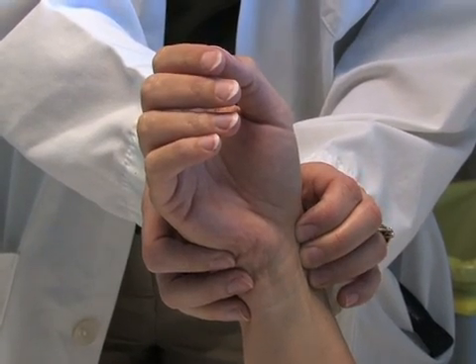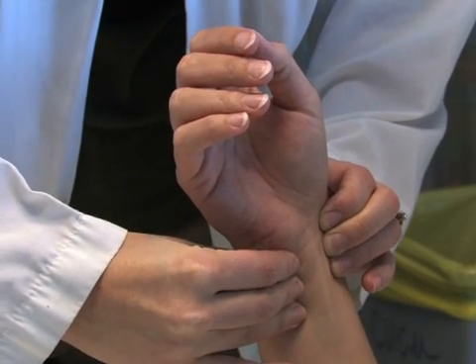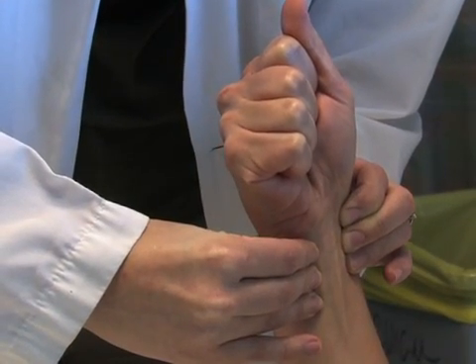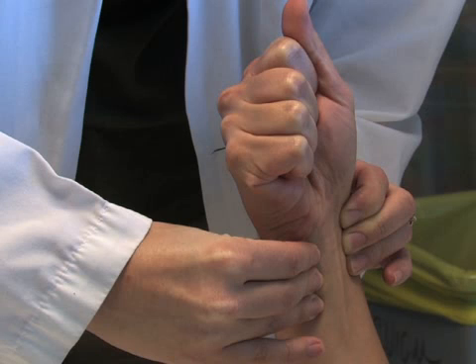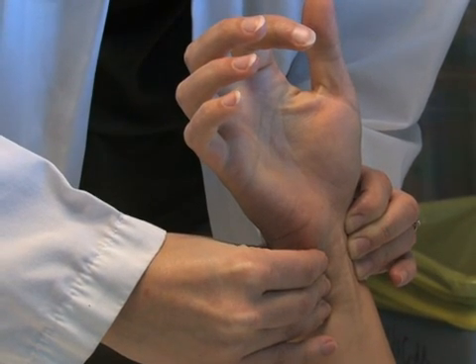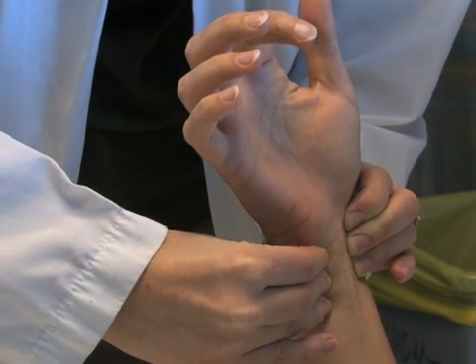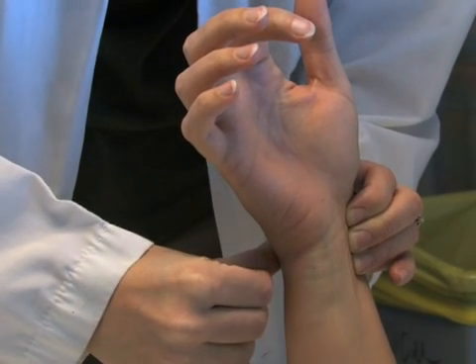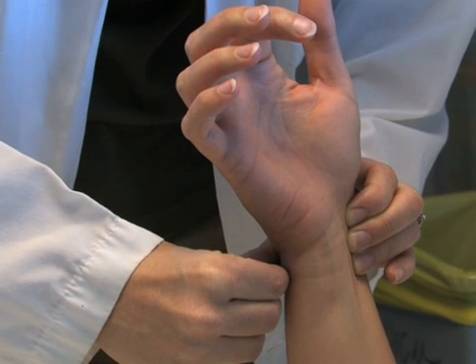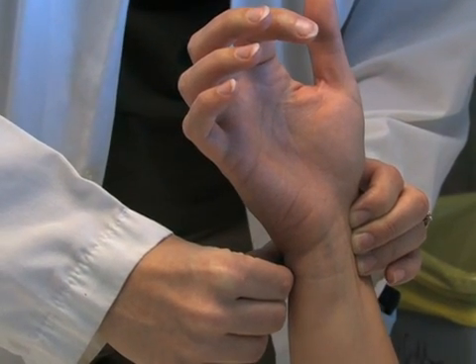To perform the Allen test, occlude both the ulnar and radial arteries. Instruct the patient to make a fist to drain the blood from the hand. This should be done for approximately 30 seconds. Instruct the patient to unclench the fist; the patient's palm should appear blanched or pale. Now release pressure only from the ulnar artery. Adequate collateral circulation is indicated by the return of normal colour within 10 seconds.